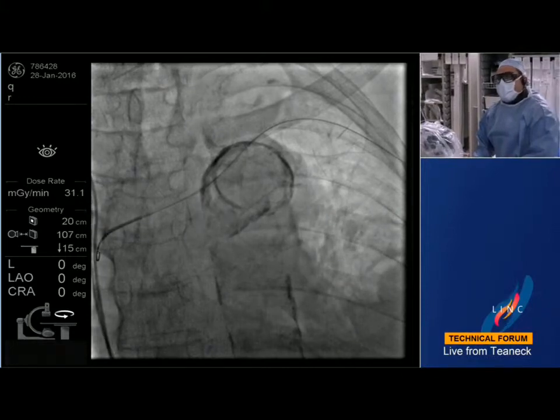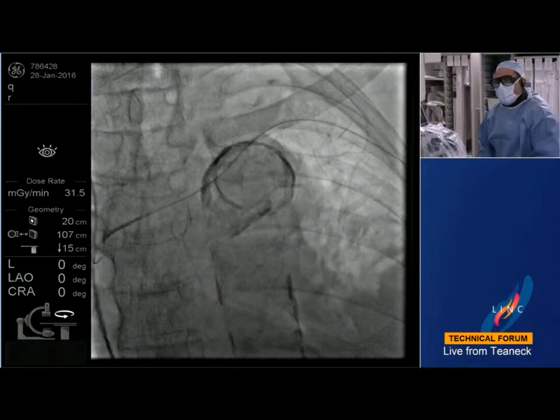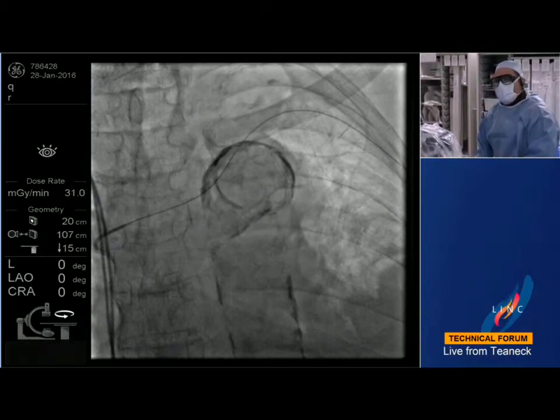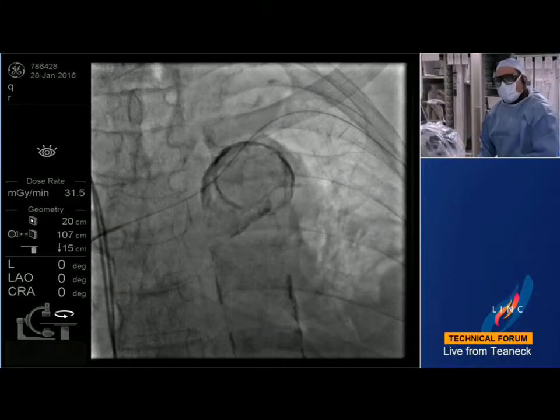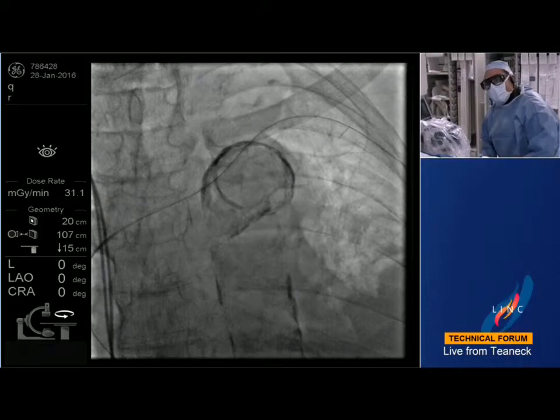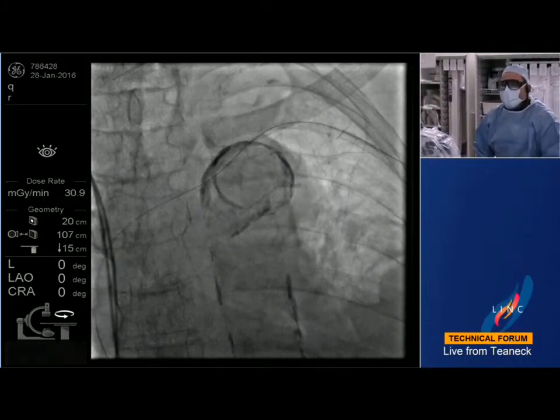Yes, and that's exactly why I was asking the panel when they would go ahead and treat this patient. The machine does have difficulty obtaining excellent dialysis for this patient, and he does have some left upper arm swelling.